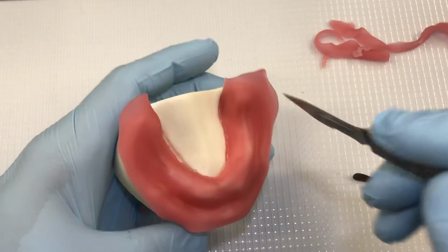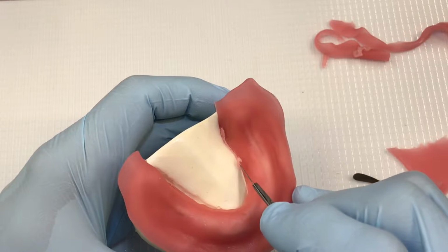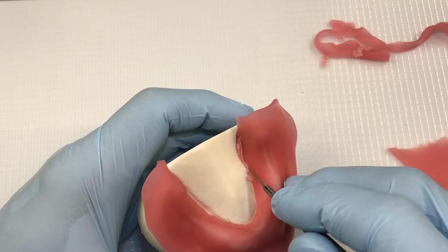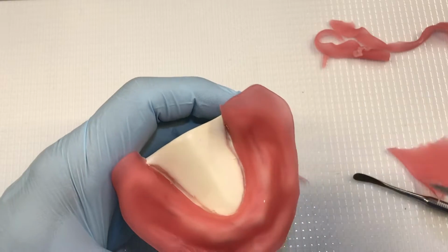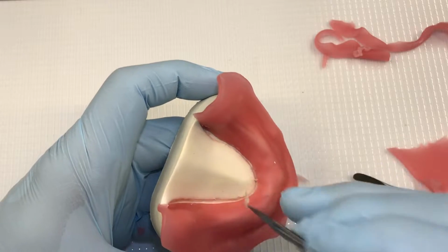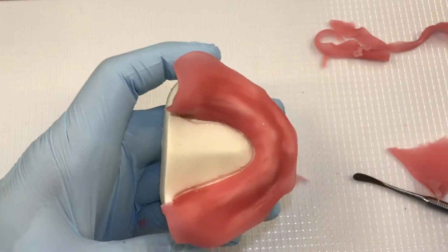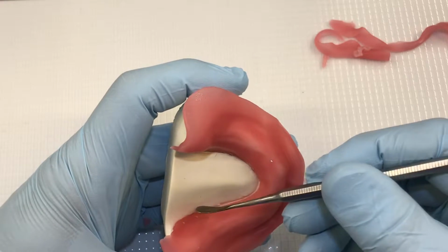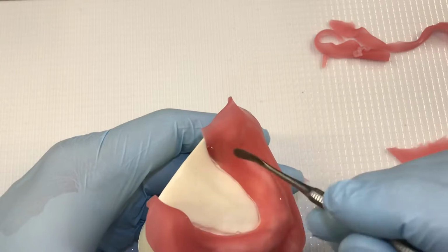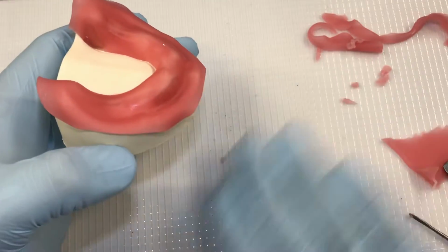And you want to make sure that you are clear of the edge of the land area because you want some room in there to flow some wax, just like we did on the maxilla. So right there's a little bit of room that I can flow some wax in there to make the peripheries nice and smooth and rounded as if it was the finished product in acrylic, although it's not. And that just adds patient comfort, and I think when they're comfortable, they work a little bit better with you. And it builds up patient confidence too, because nothing feels rough, nothing is hurting.